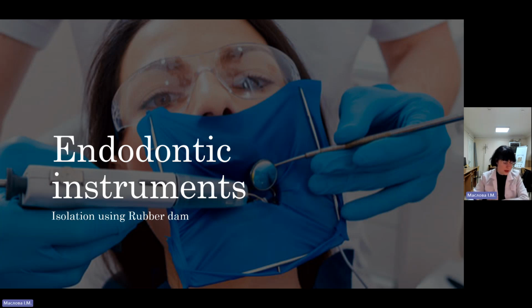its application. The rubber dam is essential for root canal treatment and offers the following advantages: asepsis, prevention of saliva contamination, improved visibility, soft tissue protection, confinement of excess irrigant, reduced liability. It may be deemed appropriate to initiate access prior to placement of the rubber dam, and this allows better appreciation of external root contour and tooth position. The rubber dam should be placed as soon as the pulp chamber is identified for the above reasons.